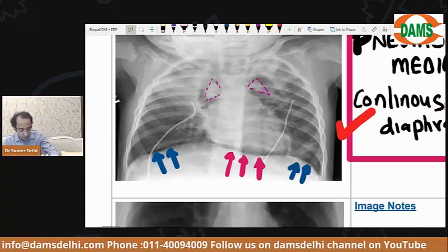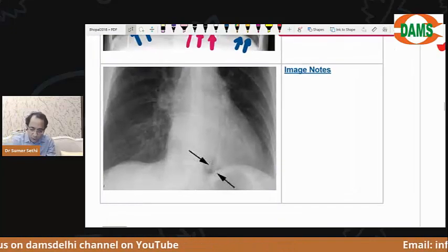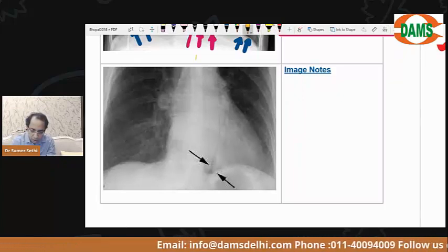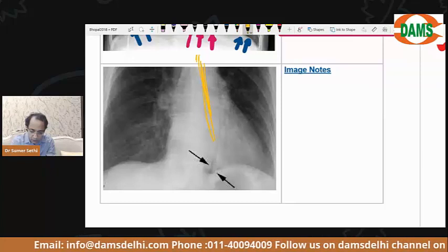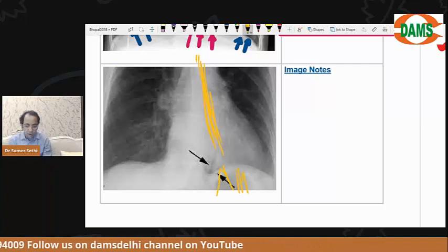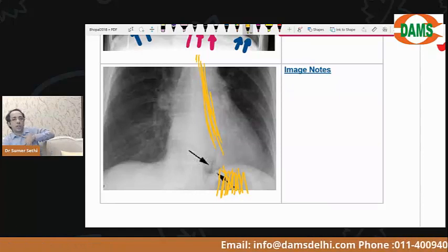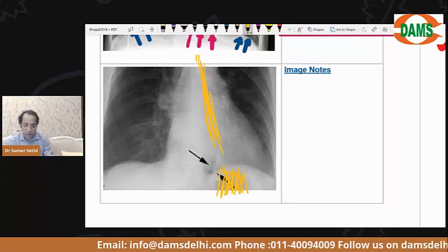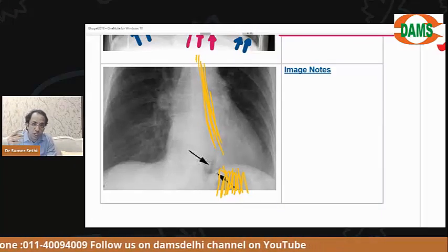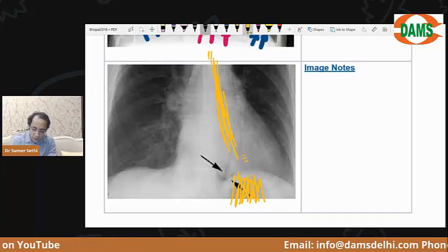Okay, now once you are clear, another point to understand is in your thorax. The esophagus starts in the midline, but then it starts to go towards the left and it meets the stomach. Do you remember? It goes gradually towards the left and meets the stomach. And in surgery, they might have talked about esophageal perforation, a syndrome called Boerhaave syndrome. So often you see a leak at the lower end of the esophagus.